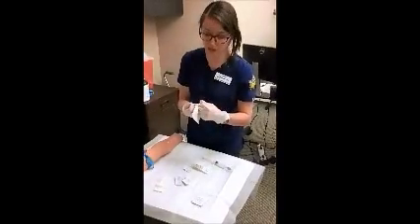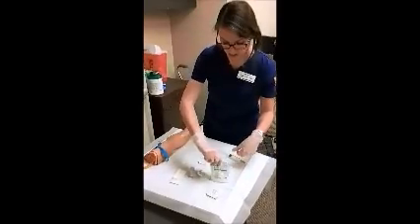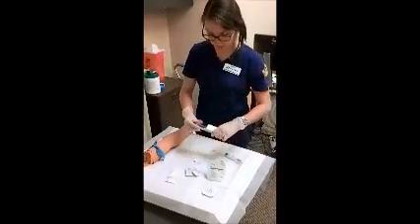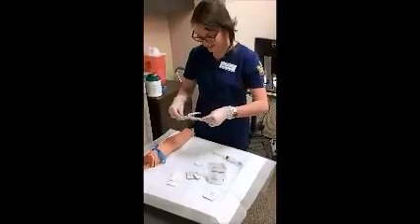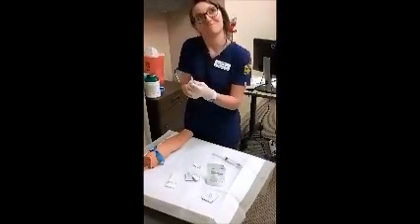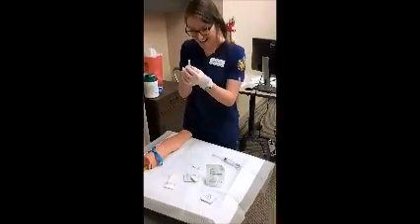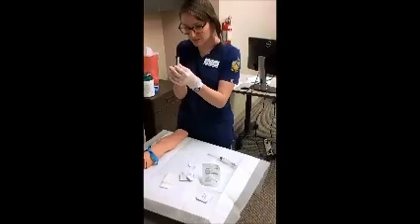Always making sure to talk to the patient. Some people get really, really nervous when it comes to IV insertions, and so maintaining a nice conversation with them will help them feel a little less nervous. So we're going to pull our IV catheter out, and we're going to maybe pop that off of there. Okay, and we want to loosen the hub a little bit because sometimes those little guys can get stuck.